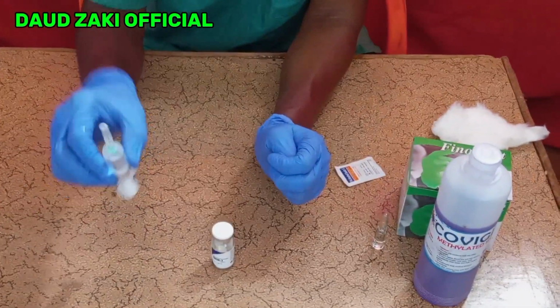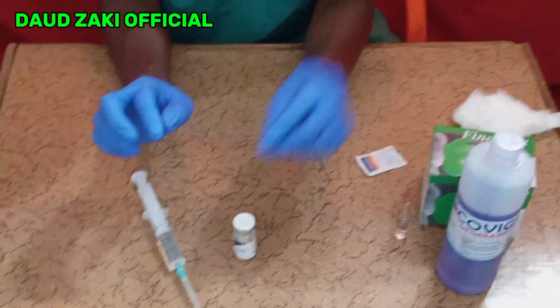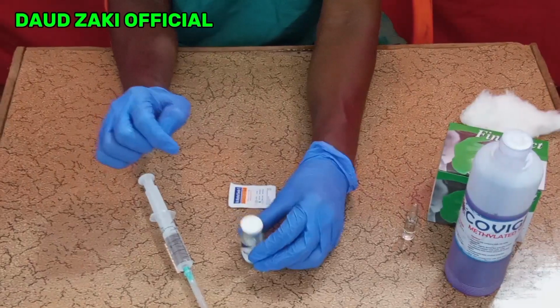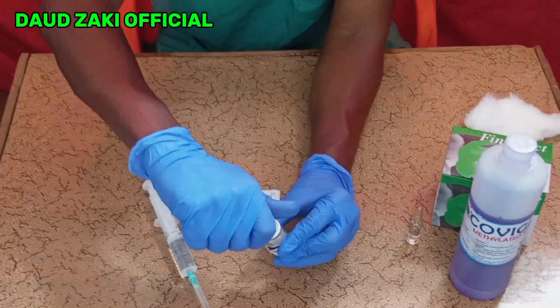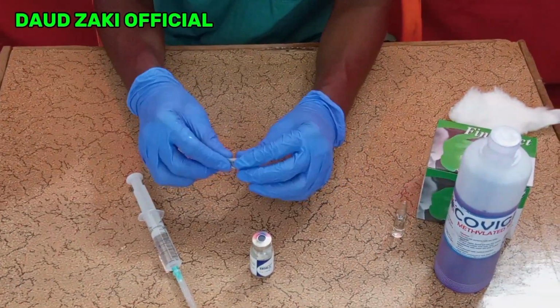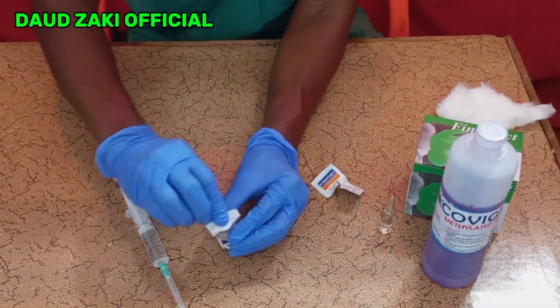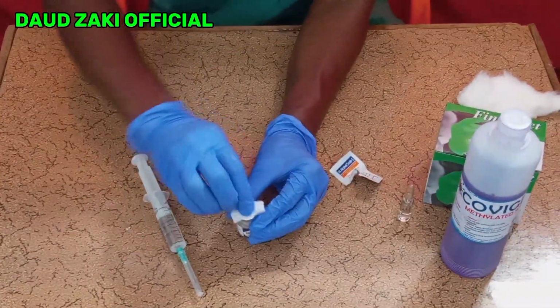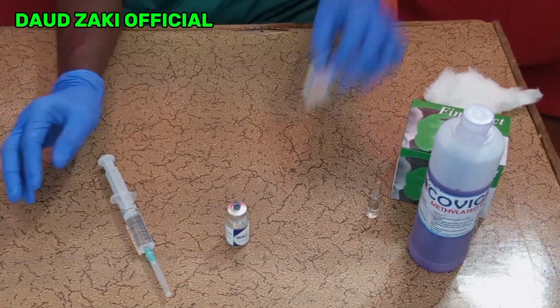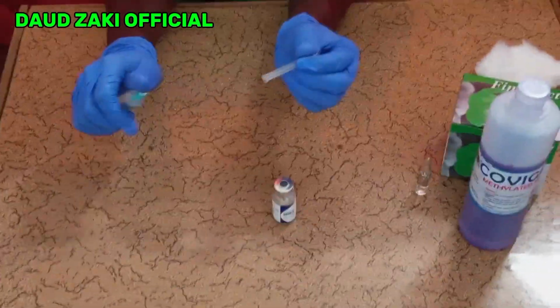Now we want to reconstitute the vial with the sterile water for injection so that the drug will be in solution form. Then you need an alcohol swab to clean the opening of the vial. First, you get the vial, you flip open the cap, then you clean the opening of the vial with an alcohol swab. You have to clean the opening of the vial with an alcohol swab to ensure that the vial is completely safe for you to inject the needle.